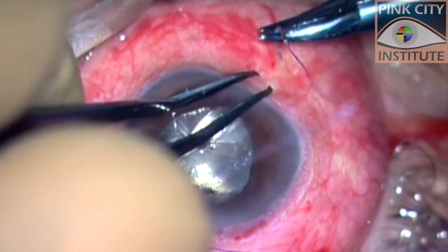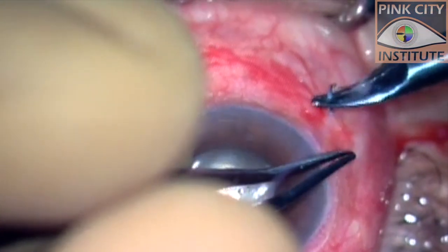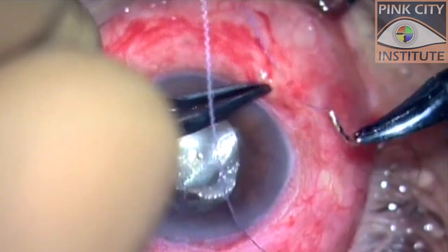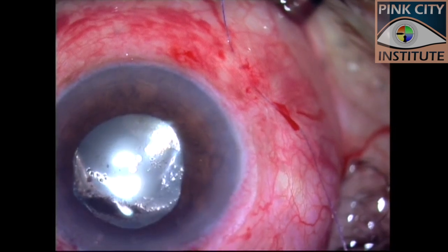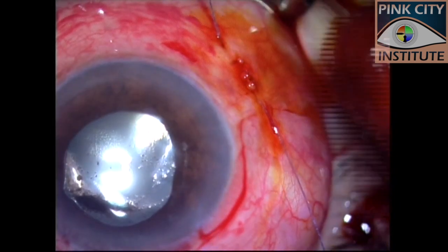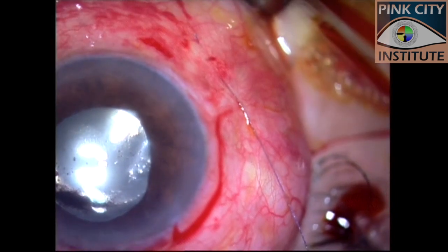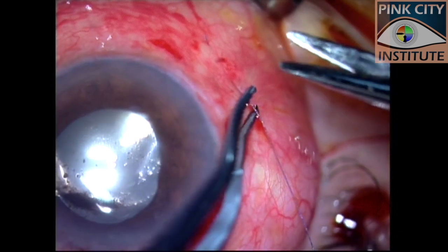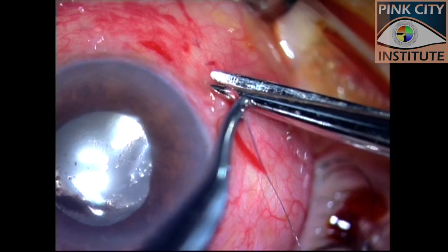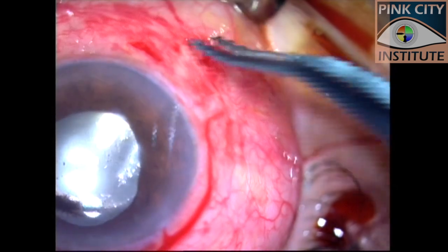As demonstrated in the previous case, a 7-0 polyglactin or Vicryl suture was passed perpendicular to the sclerotomy. A negative Seidel's test gave us an indication that tying the two surface ends was unnecessary. Both ends of the suture were hence cut.